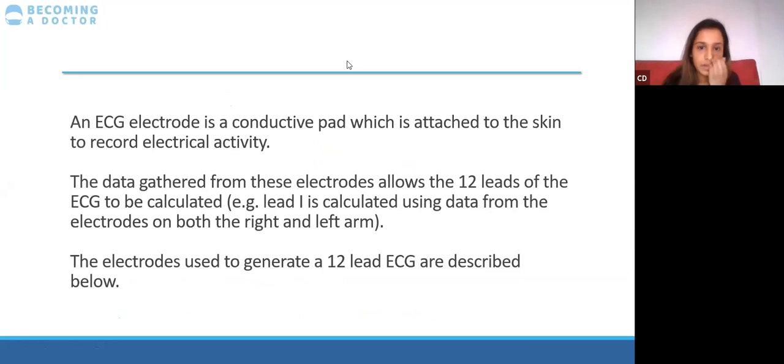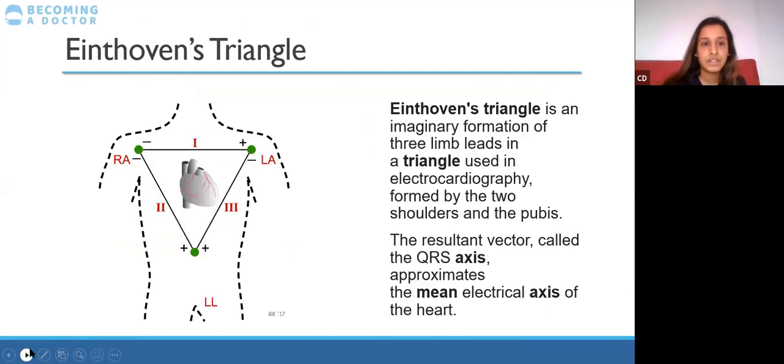Each section looks so different, so I can't compare them to the normal ECG and how to spot abnormalities. I don't really understand this question. When the person who does the pathology lecture comes in, hopefully they will also have a normal ECG and then show you how to spot the abnormalities. But they shouldn't look different.